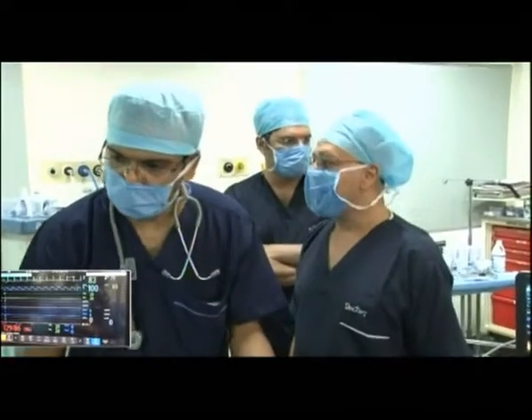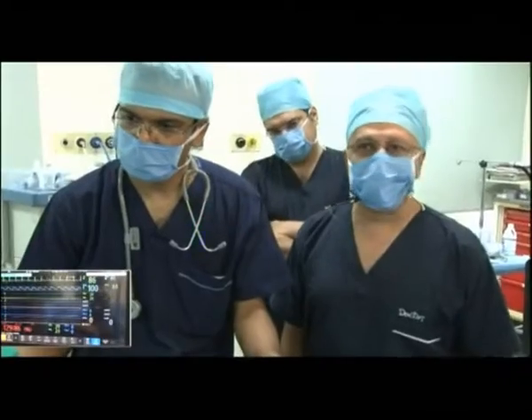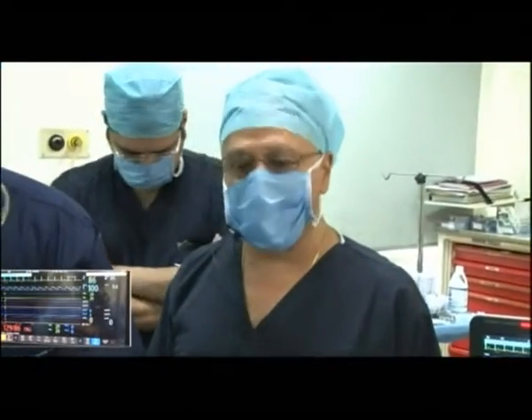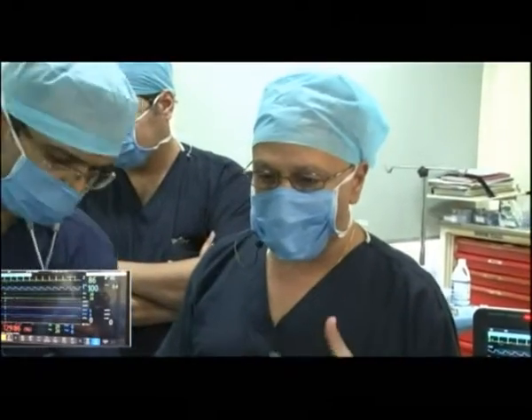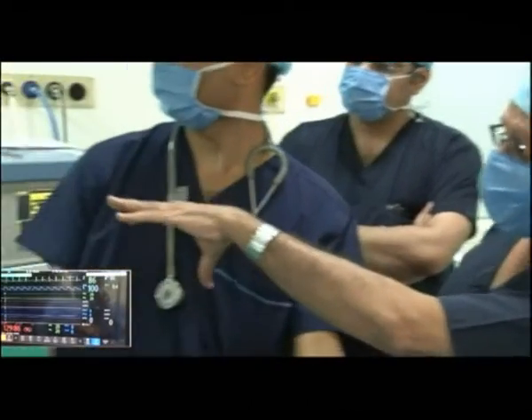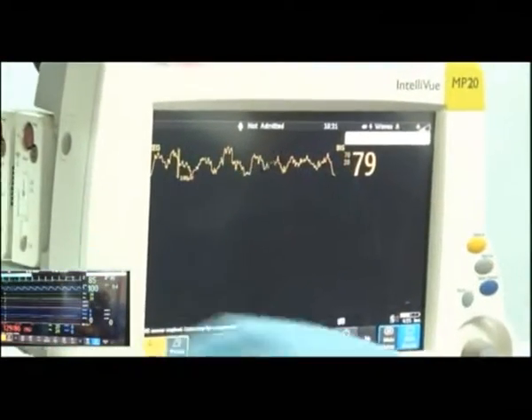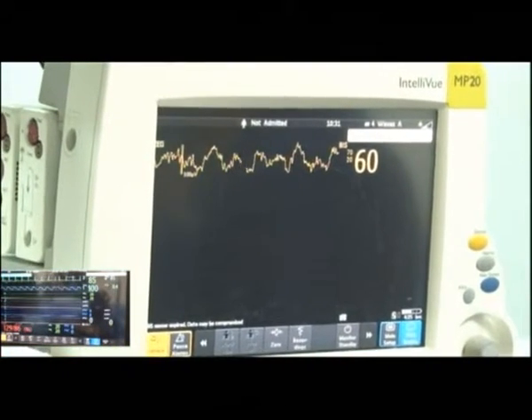Do they do anything to prevent the irritation of propofol? Yes, I would use lidocaine or lignocaine, about 10 to 20 milligrams. But if you give fentanyl ahead of time, as you notice, he has not much pain from propofol. So he's asleep, and see the BIS is going down, and obviously now we are going to be giving atracurium. Go ahead and give atracurium low dose, because it's a short surgical procedure.